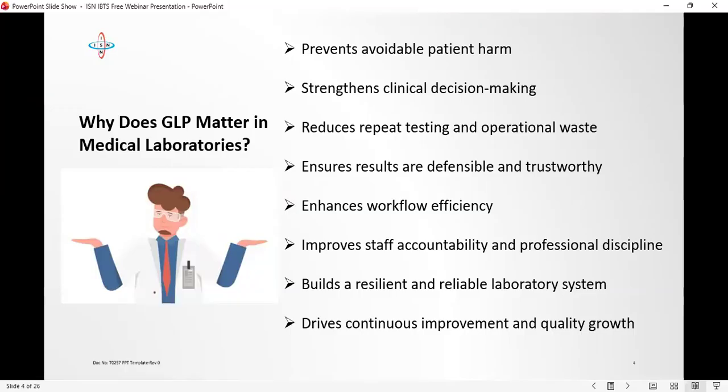So let me make this quick. There was a case in a laboratory where a creatinine result was generated, and from all analytical checks, everything looked perfect. They ran QC for the day, QC passed. Their calibration passed. The quality control was within range, the calibration was valid, and the analyzer had no flag during the analysis. So the result was released confidently. Just imagine how confident you'll be to release that kind of result.